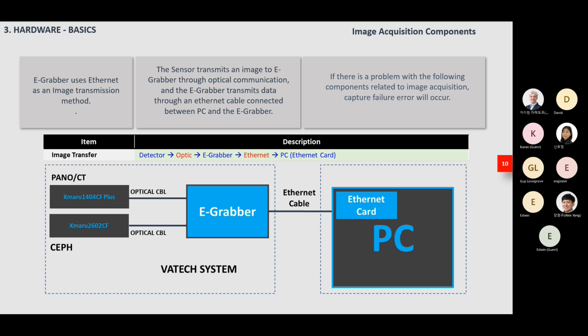The best thing to do is to think about these connections, because these connections are both for communication between the PC and the device. Also, these cables are used for the transmission of the images.